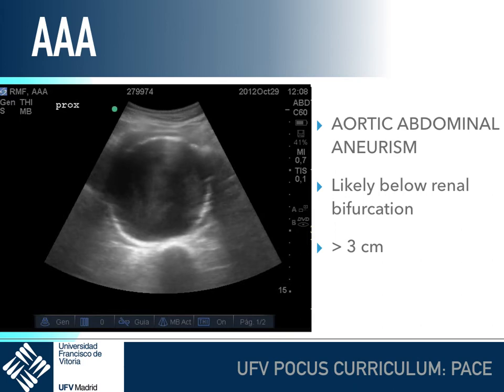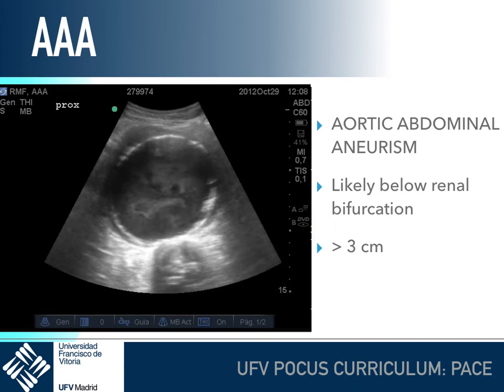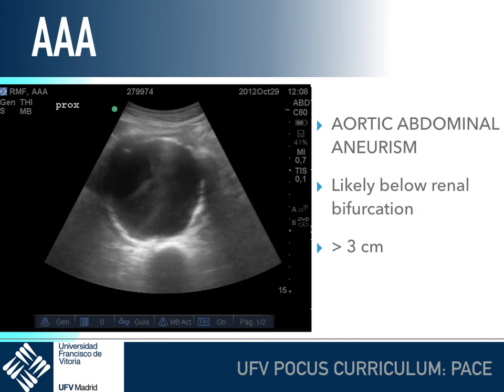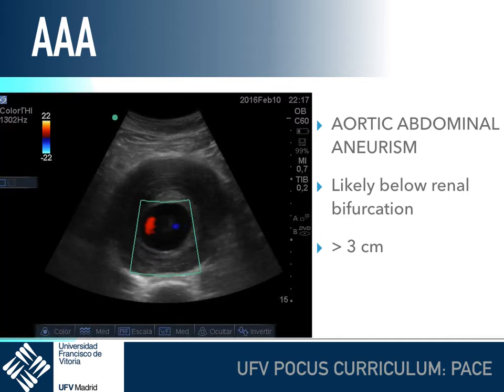In some cases they are pretty obvious and we don't need to place color or Doppler to know we are in front of an AAA. But when in doubt, put the Doppler or color on to evaluate the typical turbulent flow inside the AAA.